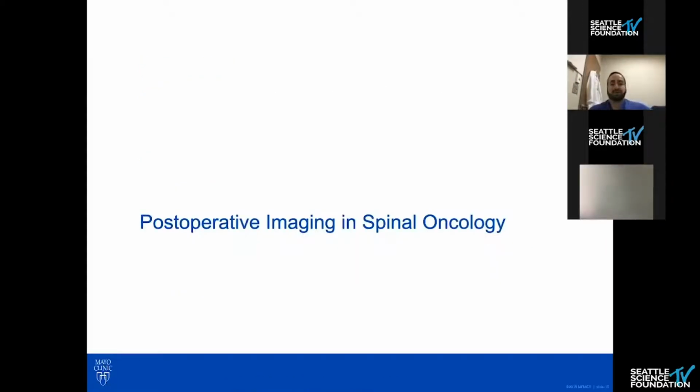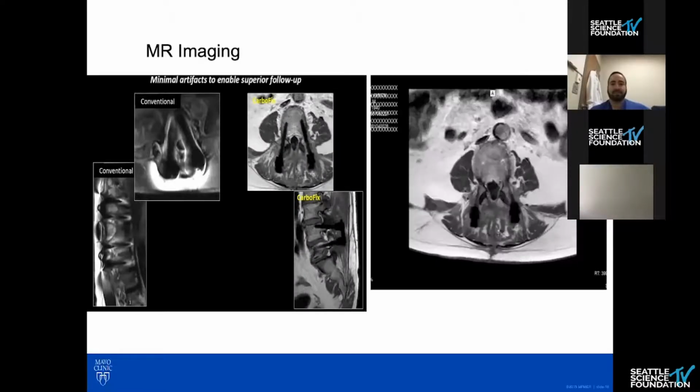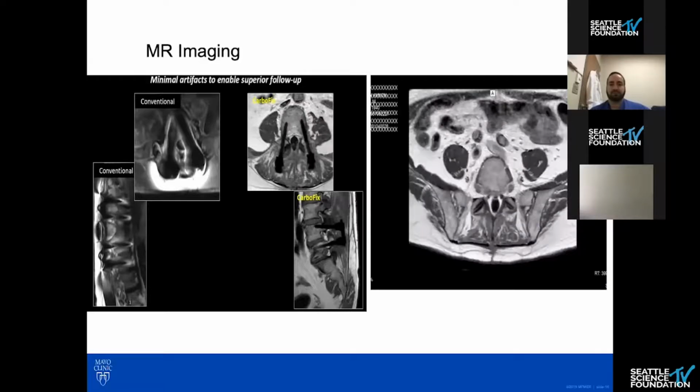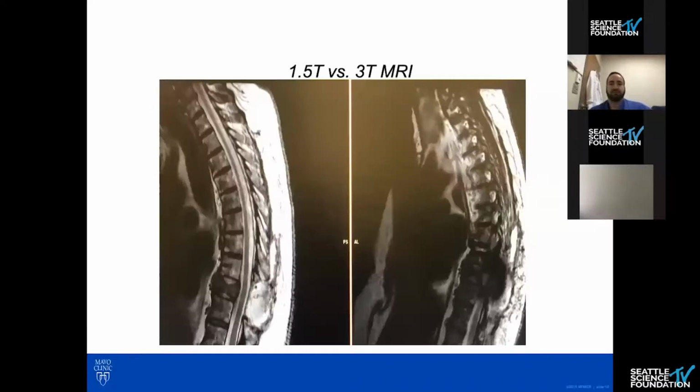As far as the imaging goes, I showed you the CT scan. This is what the MRI looks like. You can see very crisp sequences. It's a T1 sequence going through, very crisp outlines of the screw. So relevant for postoperative imaging.